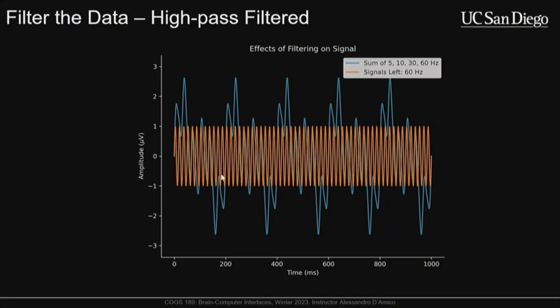So typically, when you see a 60 hertz signal in our EEG data, which is also an alternating current, it's an artifact, and we want to remove it. The way that you can do that is, for example, if you're really only interested in signals from, let's say, 0.1 to 30 hertz, which is a very common range, a lot of the times you could just apply a pretty aggressive filter from 0.1 to 30 hertz, and the 60 hertz noise kind of goes away. But sometimes you might need to specifically target it because the noise is so gigantic. And really, when you record bad EEG data that has these line noise artifacts, it's very obvious to tell. So it's not typically subtle.